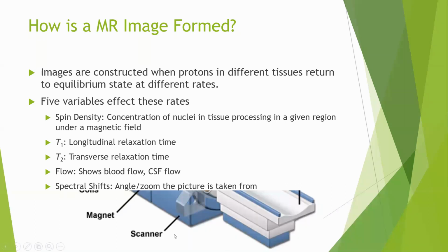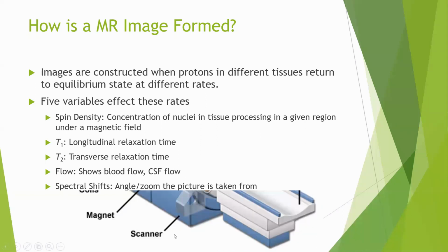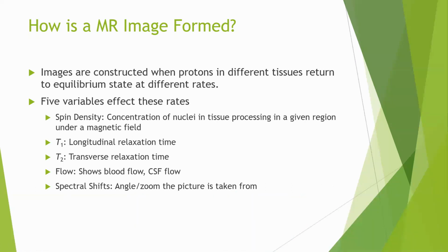The differences in the shades of gray, from black or dark to white or light gray, are because they are coming at different rates of relaxation. I can relax faster, you probably relax a little slower. So the faster I relax, the more radio frequency I emit. The slower you relax, the slower radio frequency you emit. So that emission, the speed or velocity of emission, is taken up by the scanner at different time points, creating a picture at different time points.